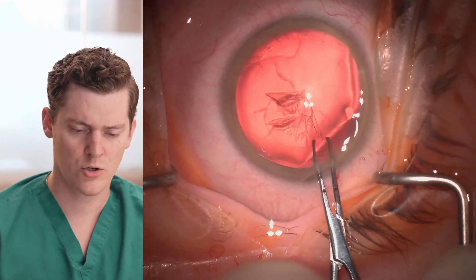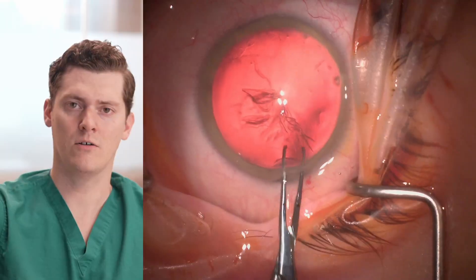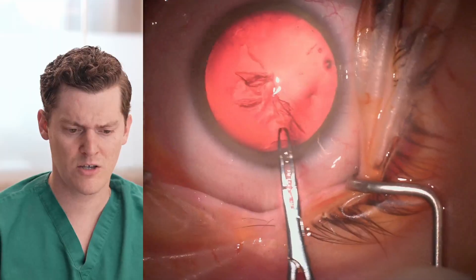But watch here — immediately after grabbing the capsulorhexis flap, it runs radial. It extends almost underneath the iris in this very dilated eye.